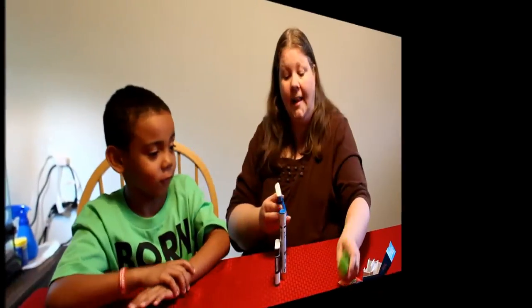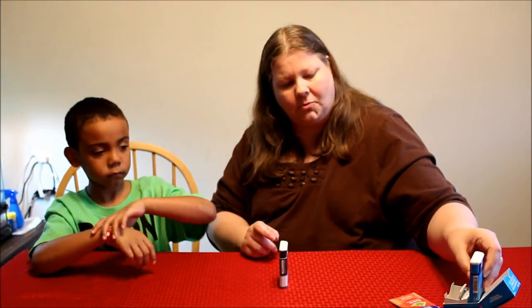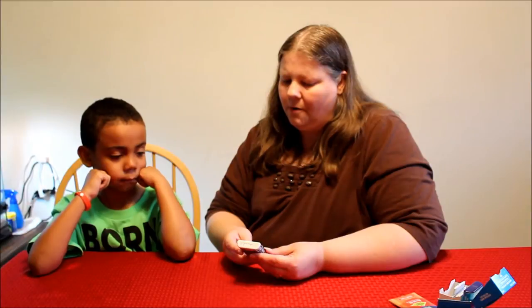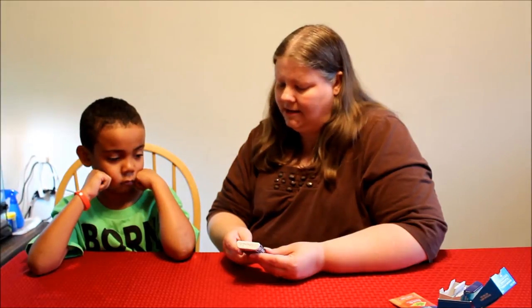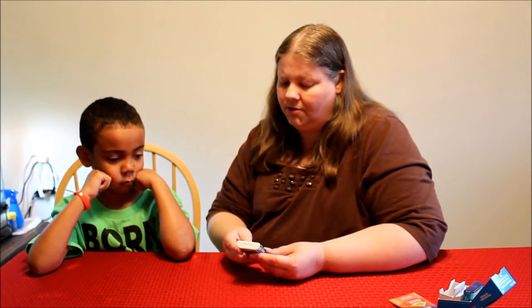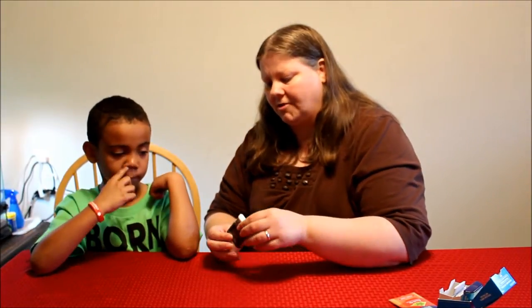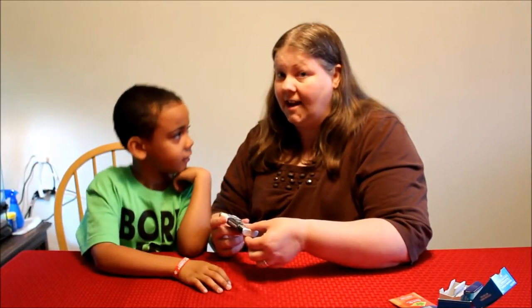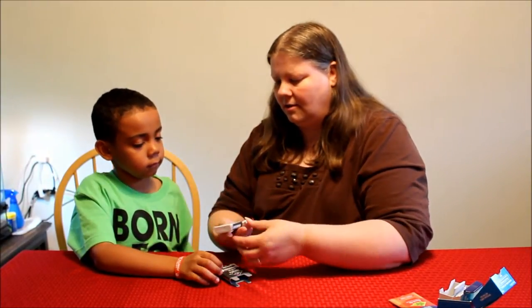Let's put away our actual AviQ and get out the trainer. The trainer contains no active drug or needle; instructions for use are found inside. This is the front and this is the back. Are you ready to try the trainer? We have to pull it right here — this is our first time, so let's see how it works.